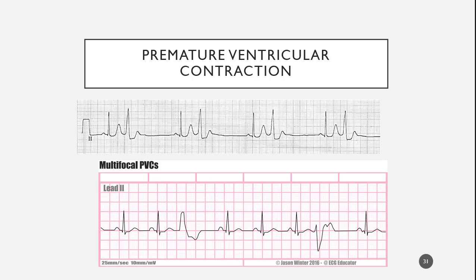Now, let me let you know a little secret. This could be completely normal, okay? There's probably something going on with this patient that you're going to want to watch your patient really, really closely. Why would I make that statement? Because there's the difference in both of the PVCs. Something else is trying to take over, which means something else could be failing, and it's just continuing down a spiral. Okay, good, Devin. Very good, thank you.